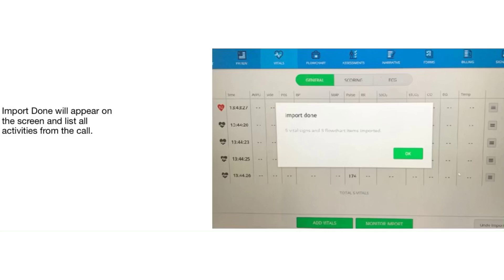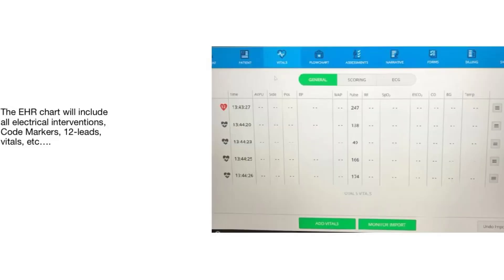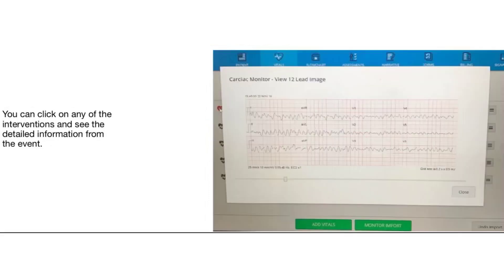Now all of the data that was uploaded from the Zoll X-Series becomes part of your EHR report. You'll now see all of the interventions that were uploaded from the X-Series, including any electrical interventions, code markers, 12 leads, vitals, and other information that was uploaded from the monitor. This completes the upload process and allows you to look at any of the interventions in more detail or complete the rest of your report, and you're all done.